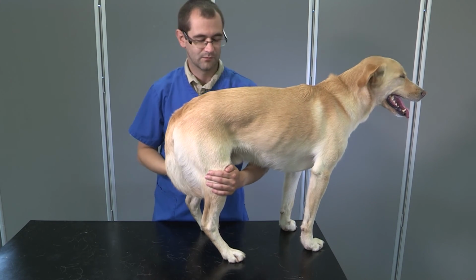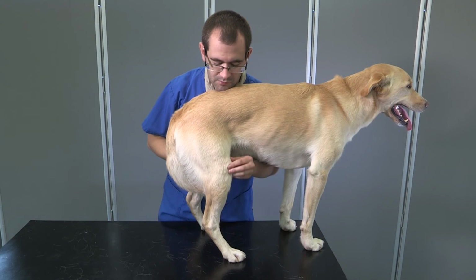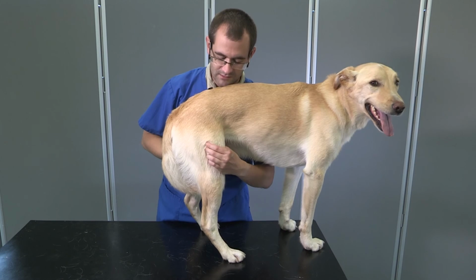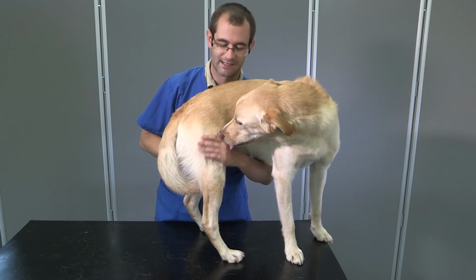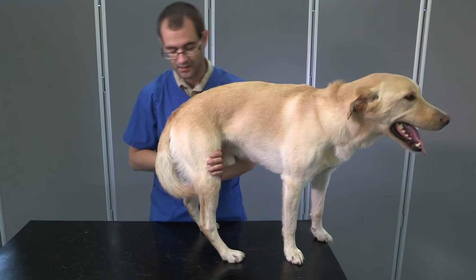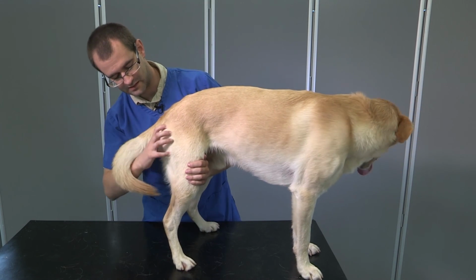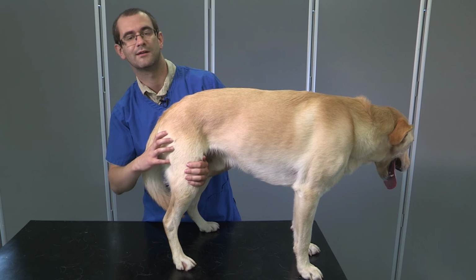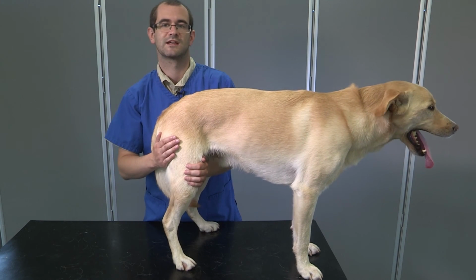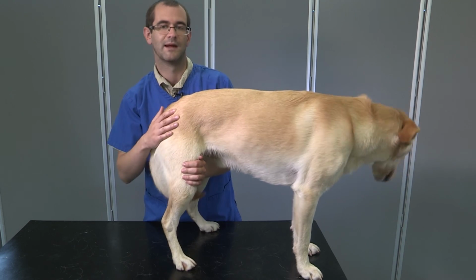Working further caudal still, we have the quadriceps. So we want to go cranial to the stifle. It's just this muscle group here. It's quite a big muscle belly that you can really get your fingers around and go in there. We want to avoid the back area of the hind limb, so the caudal area of the hind limb, just because the sciatic nerve runs down here and we don't want to inject in or around that because that can be very painful for the dog.